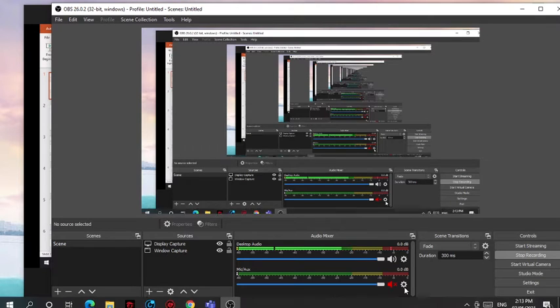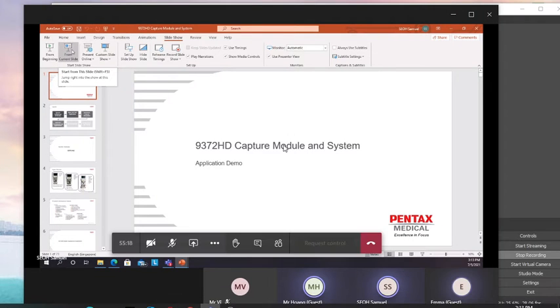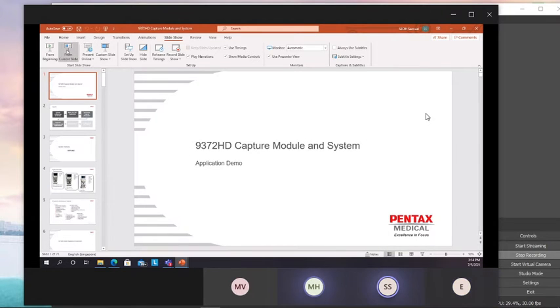Today more applicable is probably the product applications and probably the service installations. So I've completed the service side. What I'll do now is go through quickly how you use the system. Basically, I'll go through how to do a recording using the KDS application system, how you do a log-in, how you use the different functions on the KDS application system, and what the different configs that we actually have are.